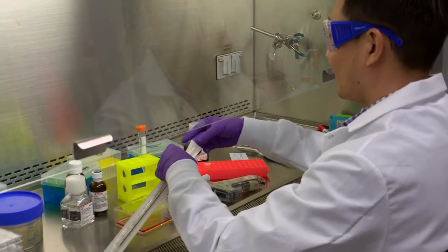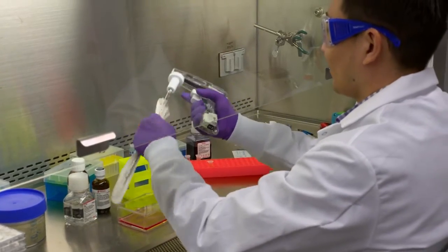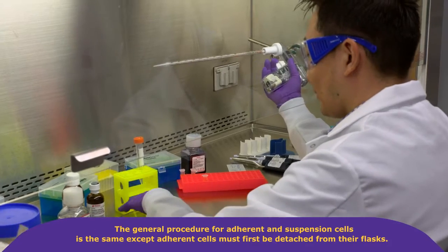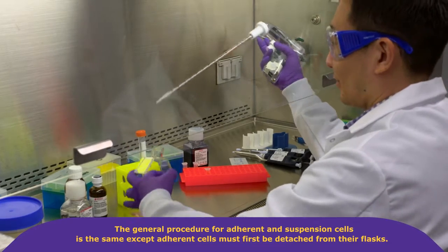For best results, cells should be growing in exponential phase and not overly crowded or confluent. The general procedure for adherent and suspension cells is the same, except adherent cells must first be detached from their flask.